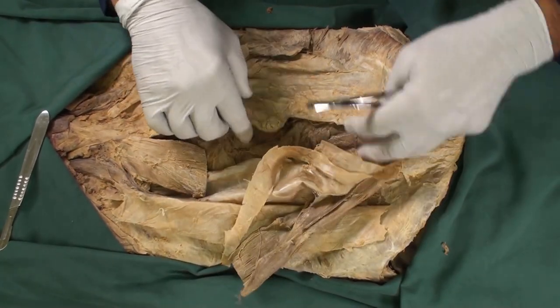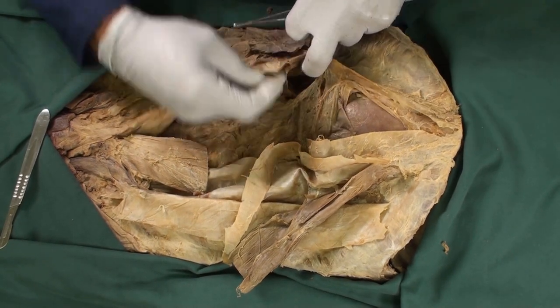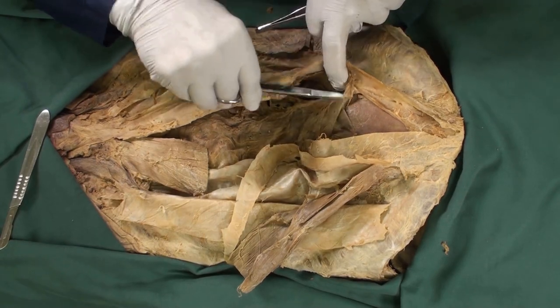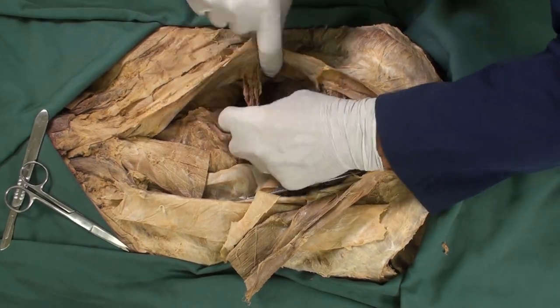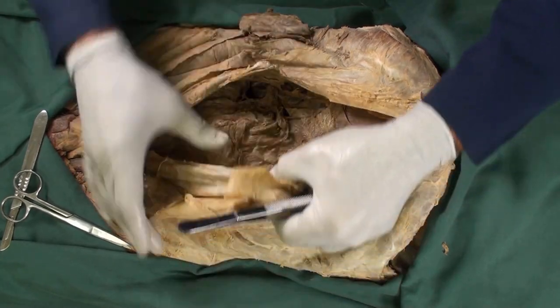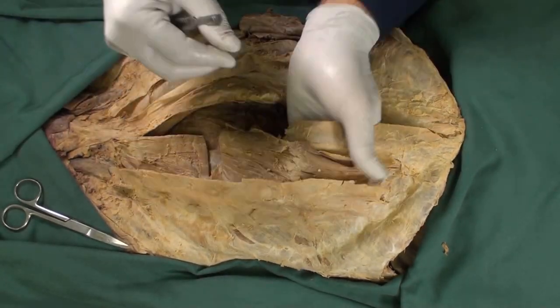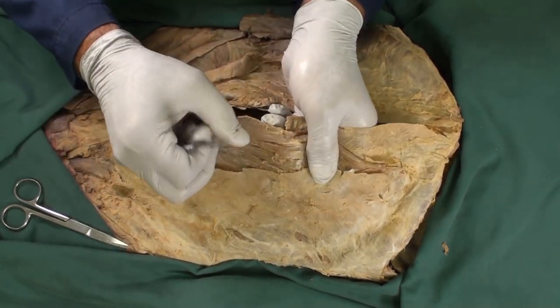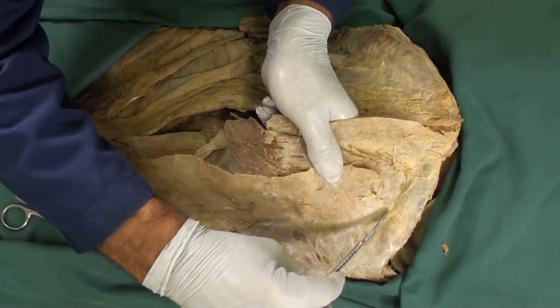I examine on the left side, and then on the right side. I'm going to actually save the falciform ligament. Detachment of the greater omentum is being done. The next step, I'm going to hold the anterior abdominal wall, pull it up, and make sure that I detach it from the abdominal contents. Then I cut along the anterior abdominal wall on the sides.